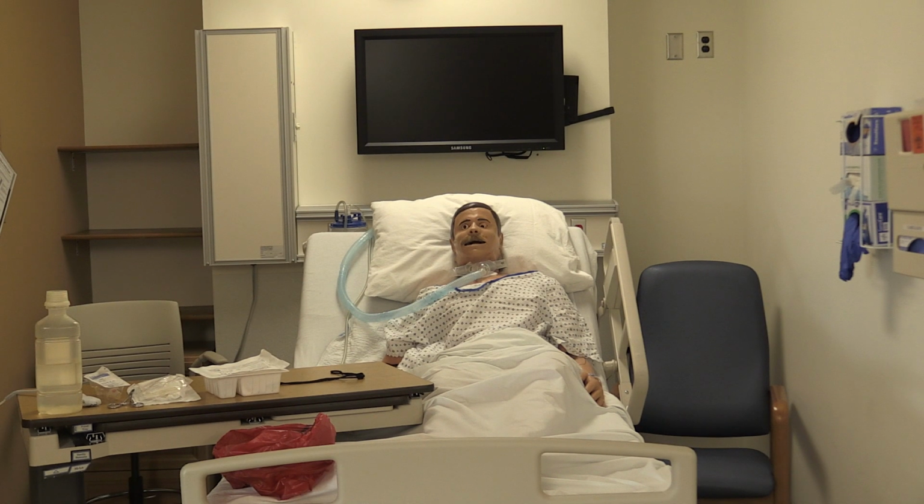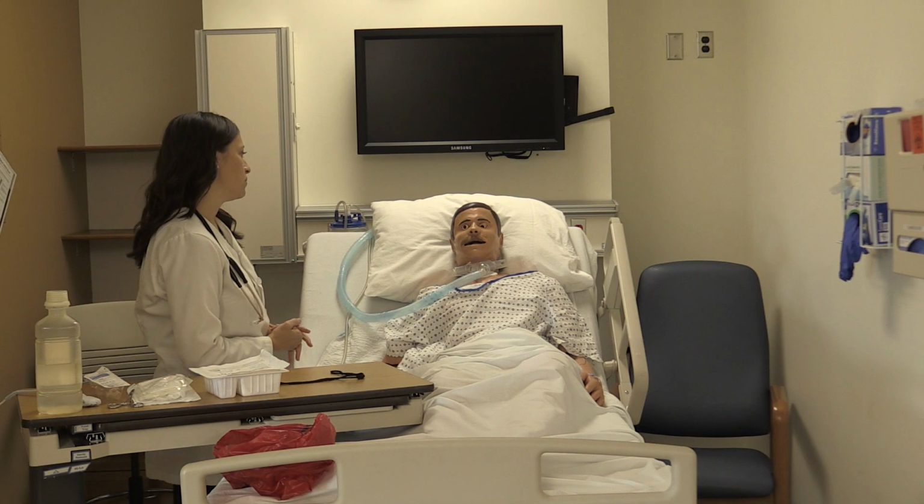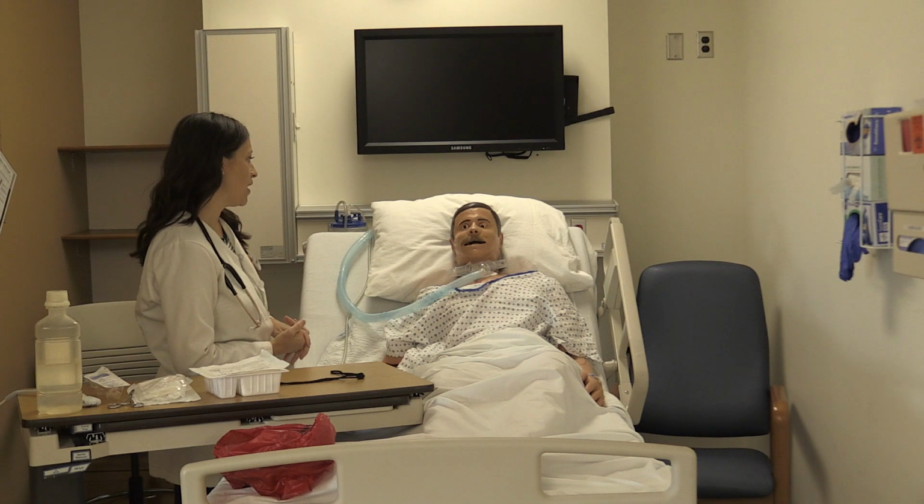Today we will be demonstrating suctioning and trach care. Good morning, Mr. Smith. My name is Angie. I'm going to be doing some suctioning and trach care for you today.